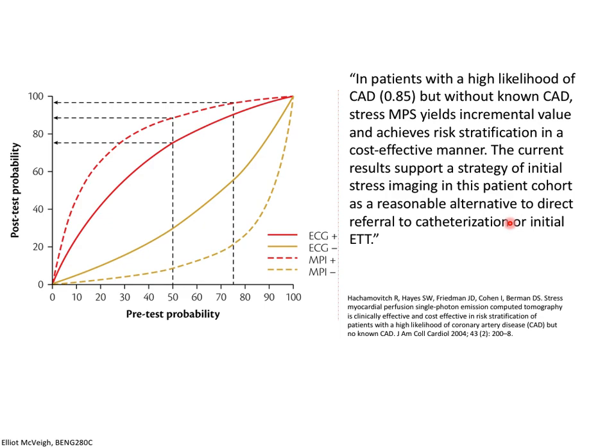Okay, so when you're evaluating, what should I do? Which imaging technique should I use to change the management of my patient? Oftentimes you do a study in which you do thousands of patients and you put them in two different pathways, and you see what the difference is in the outcomes, right? And those outcomes can be many things. They can be death from any cause, cardiac death, major adverse cardiac event or MACE, downstream after you've done your intervention.